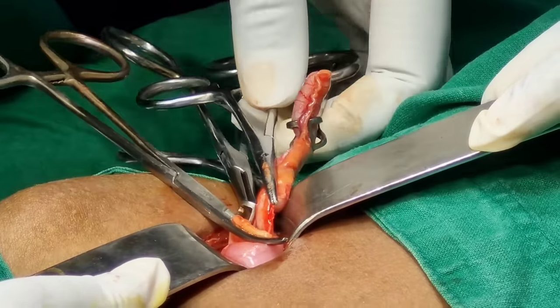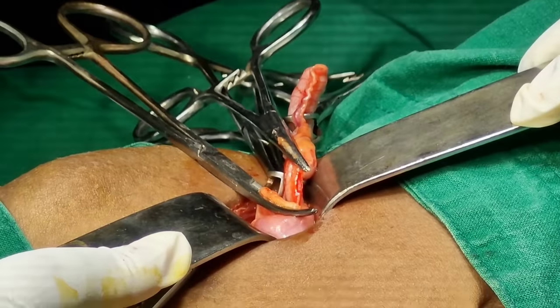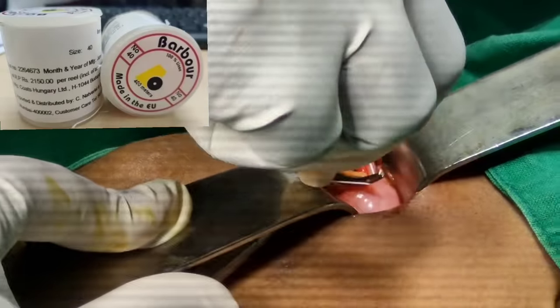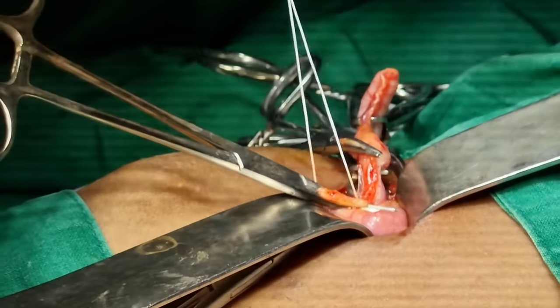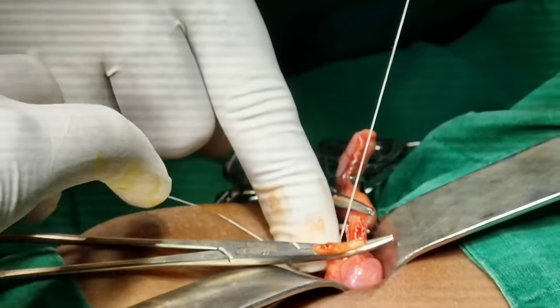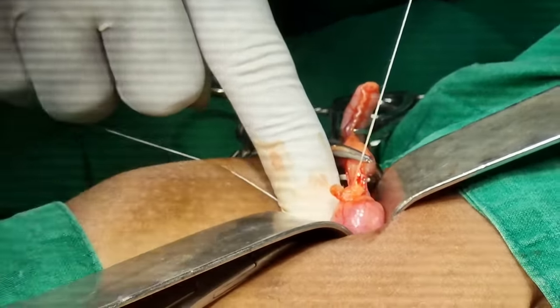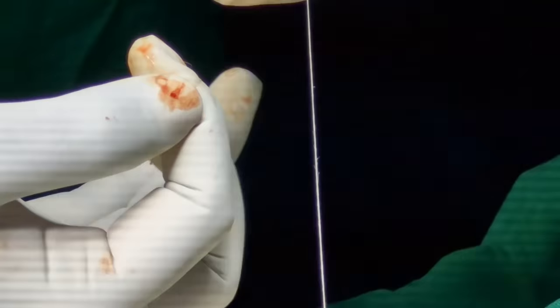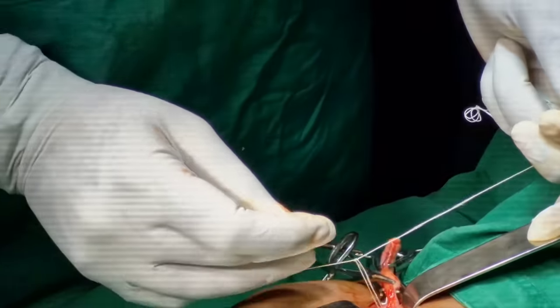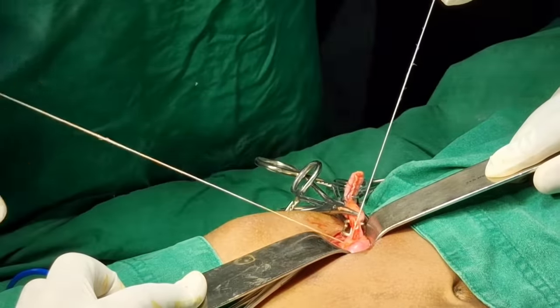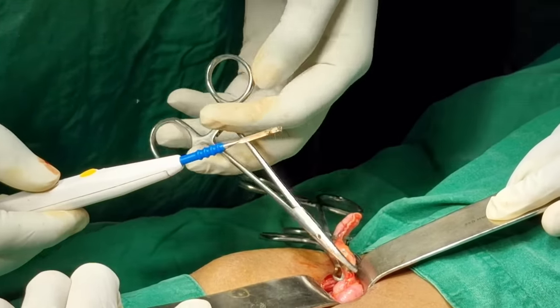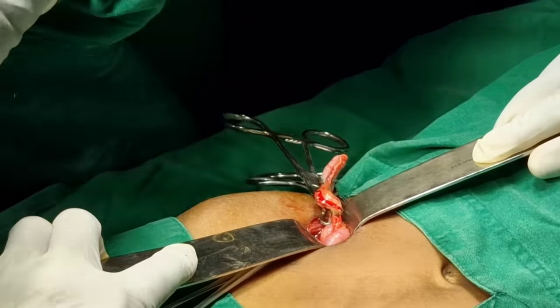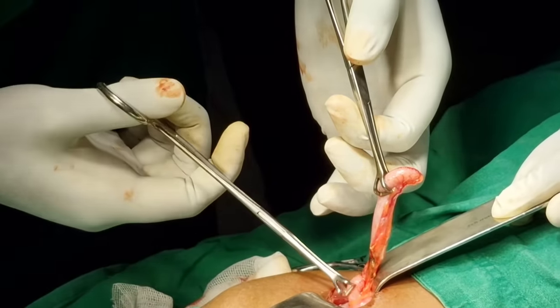After application of forceps, it is being cut. Now, you have to ligate it using barber thread. You can also use absorbable material Vicryl. The knot should be tight enough so that leaking should not be there after releasing the hemostatic forcep. See how the knot is being pushed. This is a reef knot. If meso-appendix is too large, you have to ligate it two to three times till you reach the base of appendix. Here, one more ligation is needed.